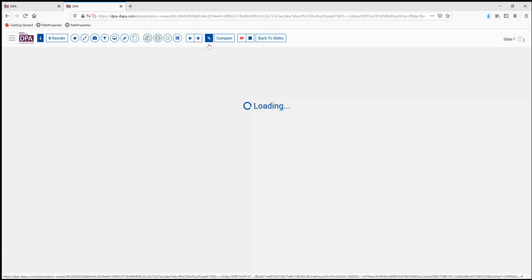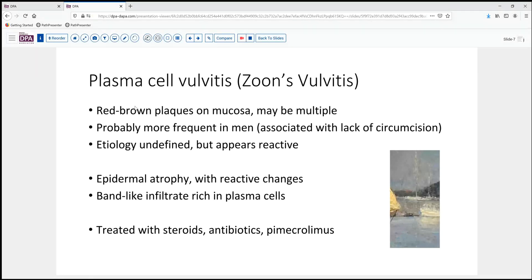Our reference diagnosis today is plasma cell vulvitis, or Zoon's vulvitis. In the penile or male genitalia, this is also called Zoon's balanitis. It's typified by reddish-brown plaques, sometimes multiple, with a glistening sheen. They're more frequently seen in men, where lack of circumcision is felt to be a risk factor, though the etiology is undefined — it might be related to some infectious inflammatory process. Epidermal atrophy with reactive changes is not infrequently seen, and this very band-like dense plasmacytic infiltrate is characteristic.